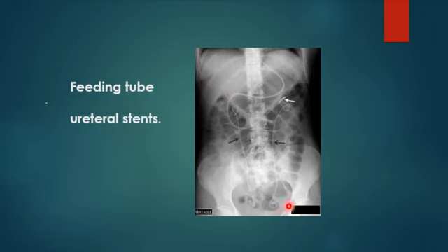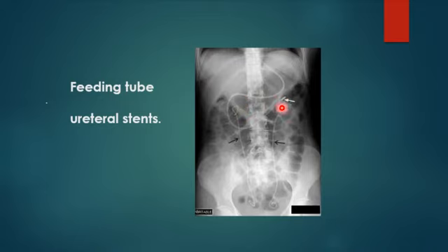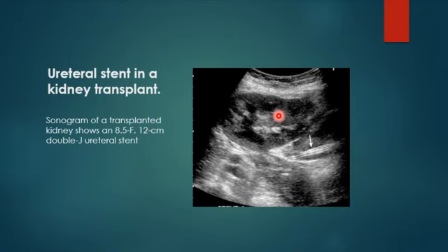This patient has bilateral double-J stents and also a feeding tube — a longer nasogastric type passing from the duodenum to the jejunum, which is normal positioning. On ultrasound, double-J stents appear as two echogenic lines in the ureter and in the bladder.